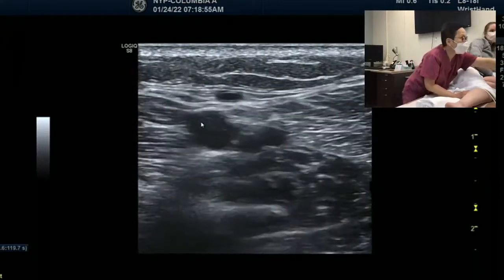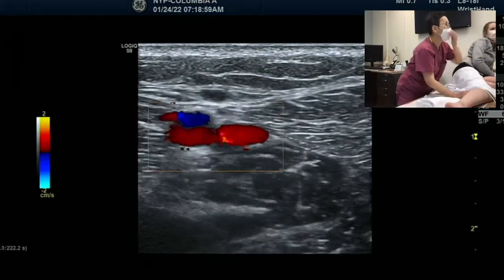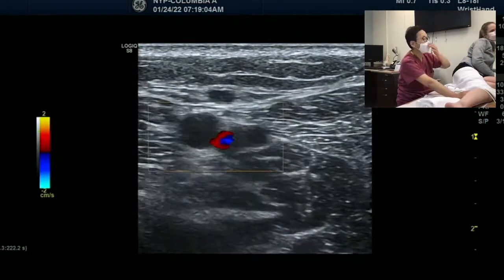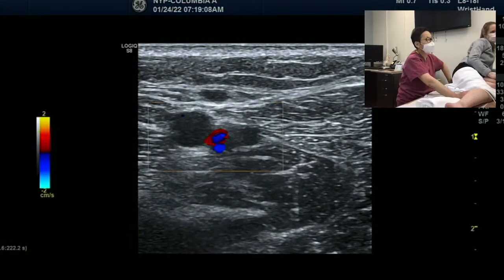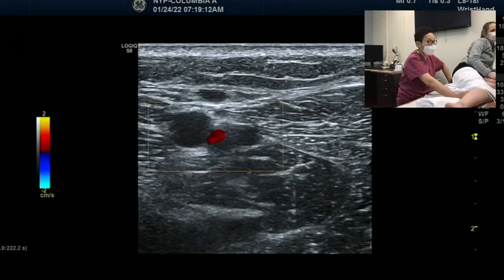Look at the good one. The tibial nerve is superficial to that. See, look, you guys see two arteries, right? On the left side of the screen is the posterior tibial artery. And the right side is the fibular artery, you remember? And then if we go proximally, they're gonna merge, right?